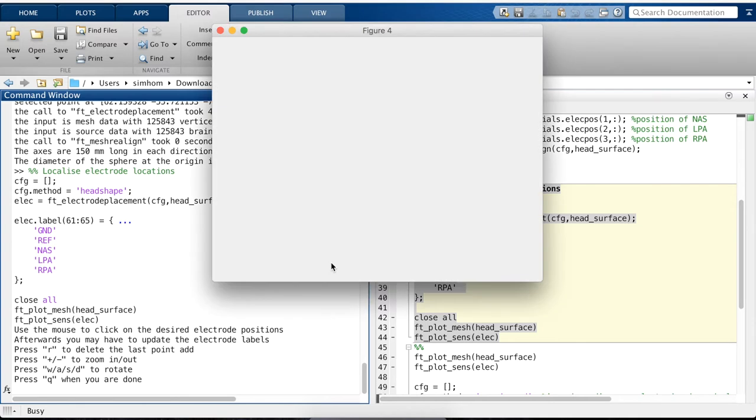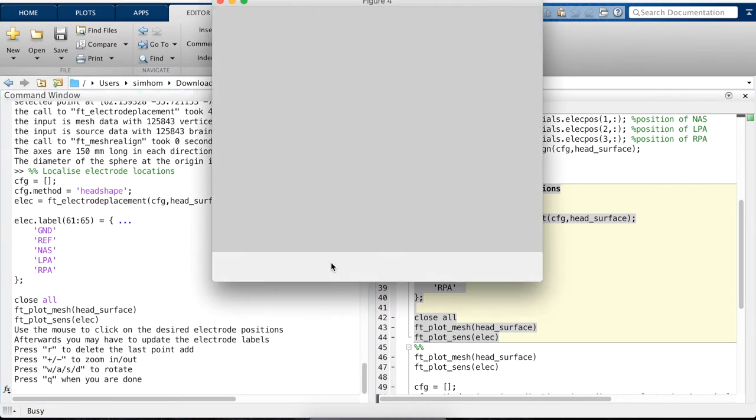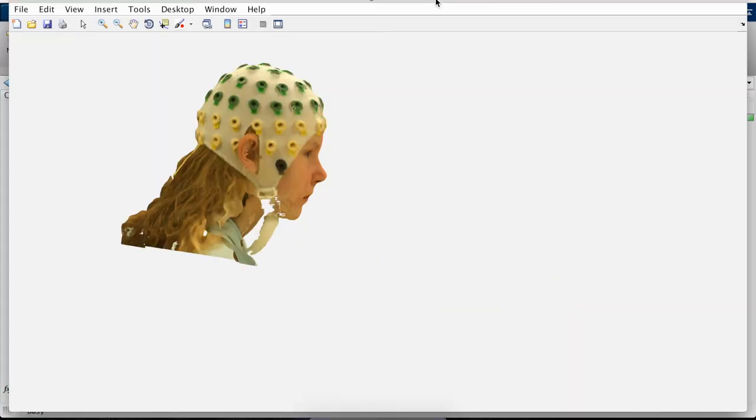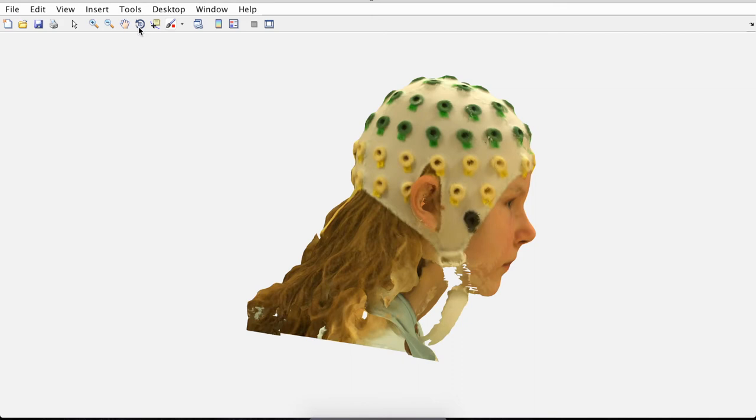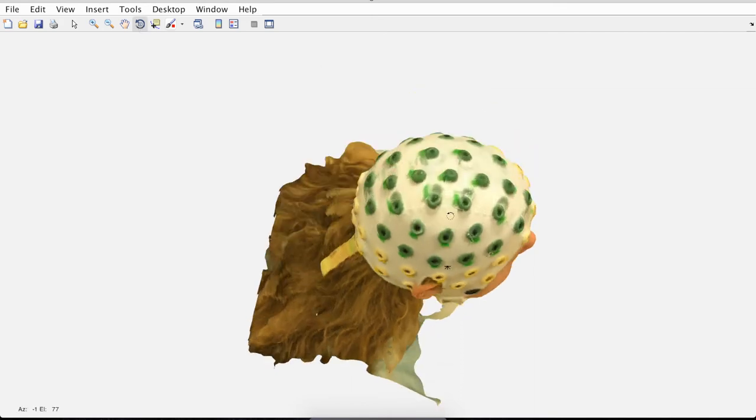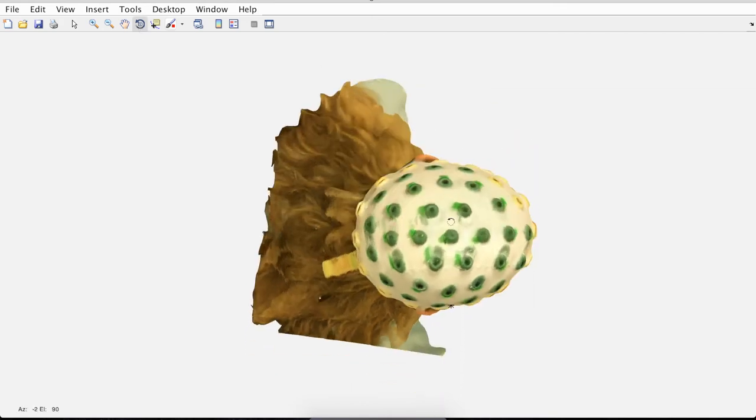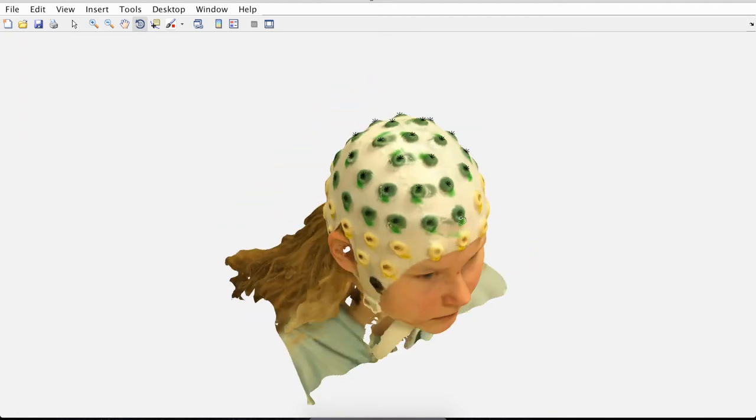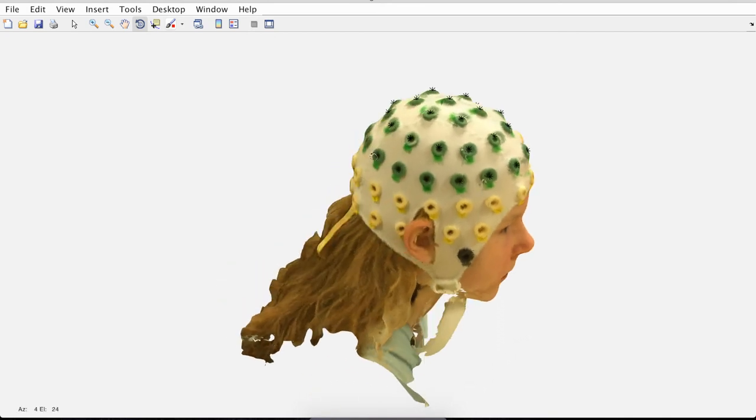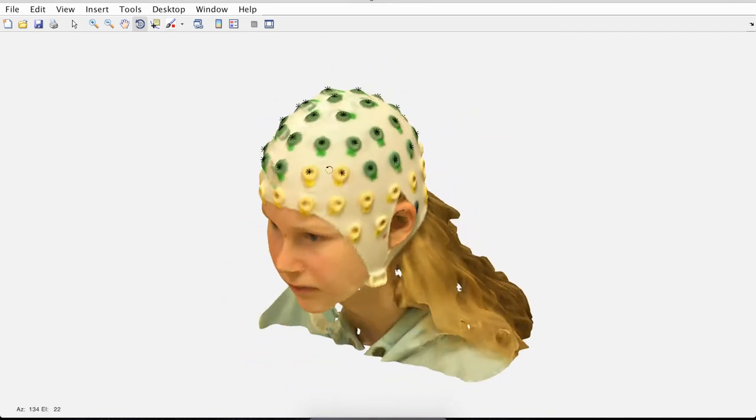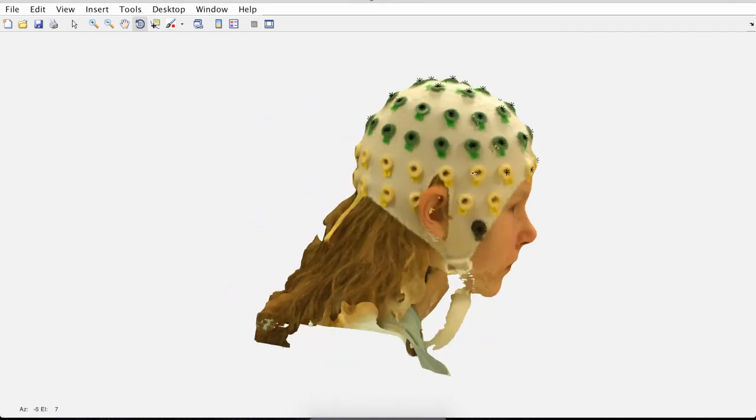Next thing we do is localize the electrode positions. Again, for this, we make it bigger. Then we firstly rotate to the head where we want to start. Press R again to remove it. Then we click in the middle. And then we can click one by one the electrode positions. Now I speed up the process and you can see how I did it quickly and rotate it and click.